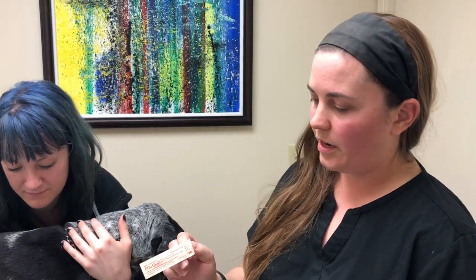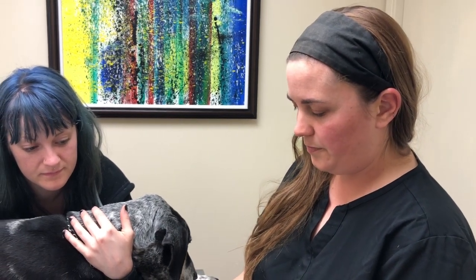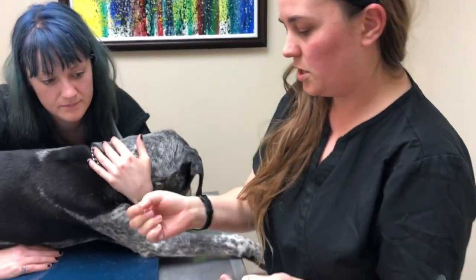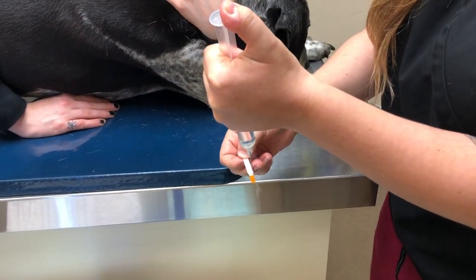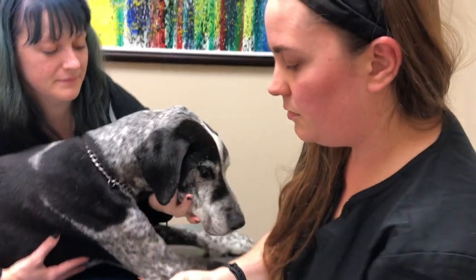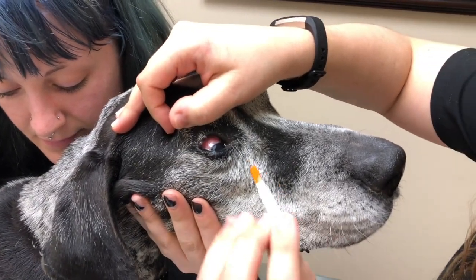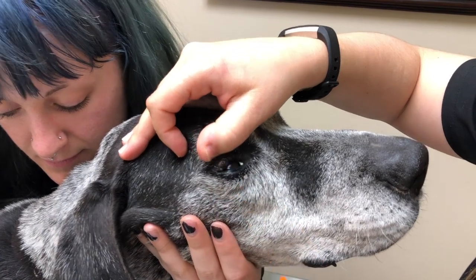So what we're going to do, I have our fluorescent strip. I'm going to pull it out, and I'm going to wet it with some sterile saline that I've pulled up in a syringe here. Just a couple of drops. So we're going to take it in Austin's eye, and I'm not going to touch the cornea, but the conjunctiva of the upper eyelid. Just a touch.